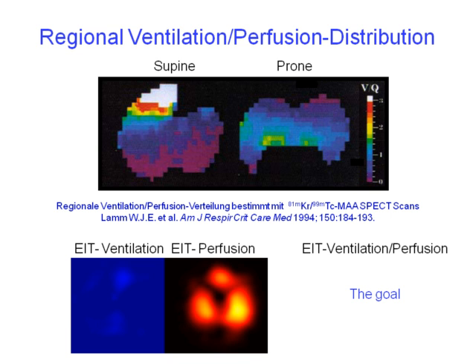I have shown you data on the electroimpedance tomography measuring ventilation. Those are data showing you perfusion measurements with the EIT. That has to be developed, that is not ready on a commercially available unit at the moment. And the goal is for sure to have an EIT measurement of the ventilation perfusion. And that, I think, would be the real revolution to adjust mechanical ventilation in the critically ill.